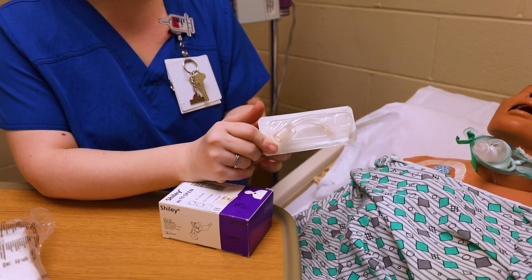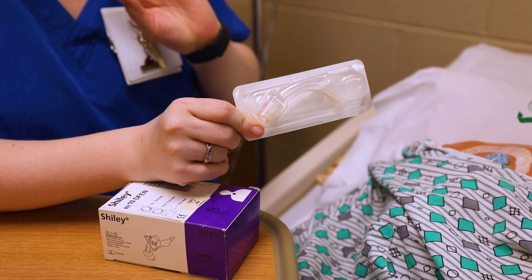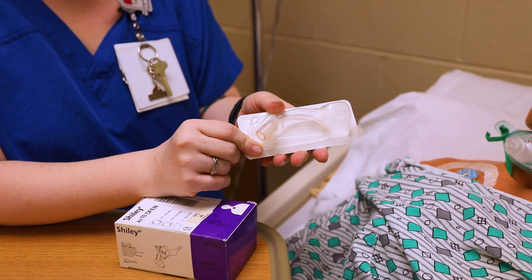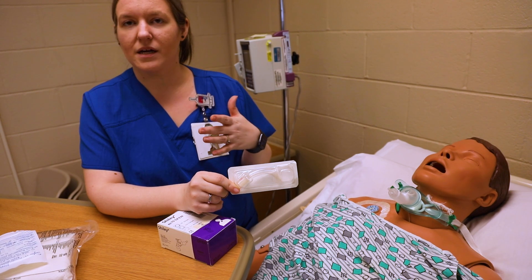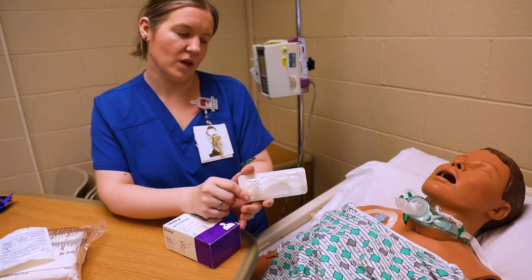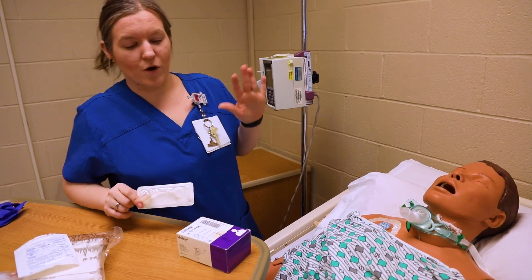This one is a disposable one. If you are using a disposable one, as you take the old trach out and put the new one in, there's a lot less cleaning to do. I'm going to show you how to do the cleaning of the non-disposable tracheostomy, because some patients — especially those who have had their trach for a long time — will have a non-disposable one.